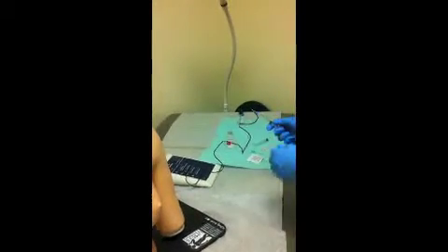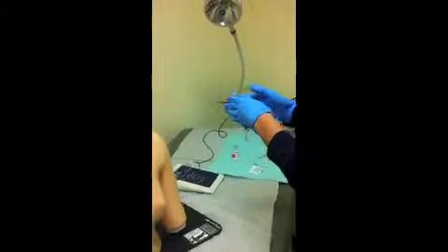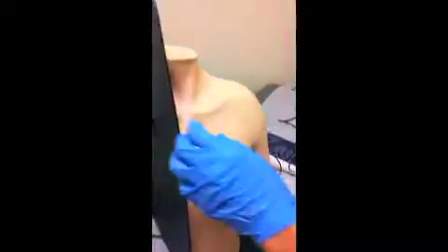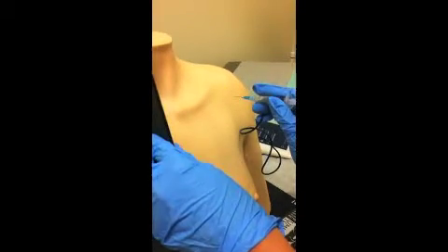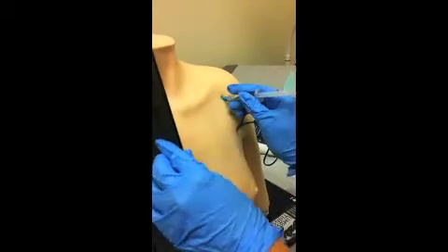And again, we have our solution mixture, which is the 1% lidocaine without epinephrine and the 20 to 40 milligrams of methylprednisone acetate that we have rolled in between our fingers to make sure it's properly mixed. Okay, and as you know, I marked my site. Alright, so for the coracoid process, we will go inferior and lateral to this particular landmark, aiming laterally into the joint space. As I mentioned, we have the arm externally rotated to open up that joint space. And you see the green light here that we are in.